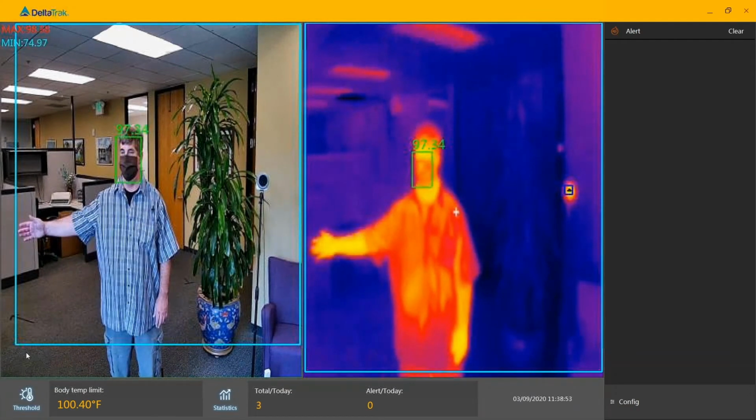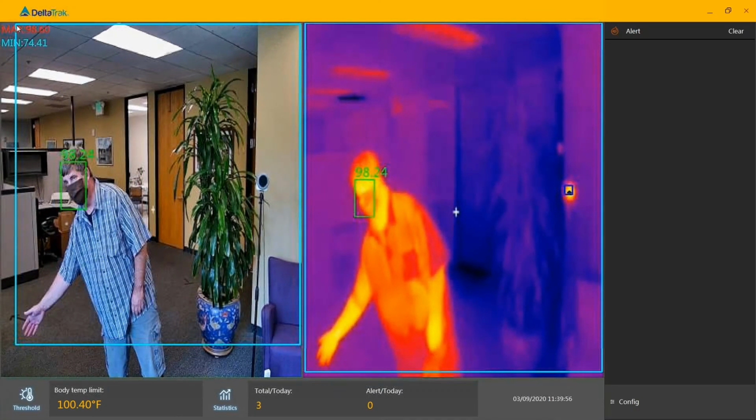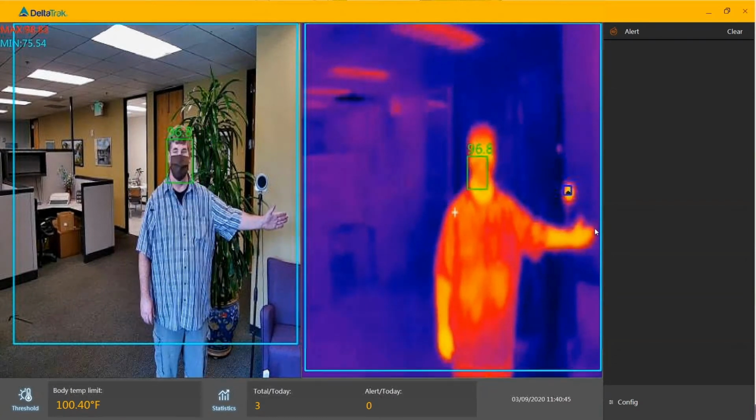Have a test subject extend their arms to 6 different quadrant positions. This is done to verify or set the edges and boundaries to match between the camera and the thermal imaging view. Be careful not to cover the black body when performing this operation.